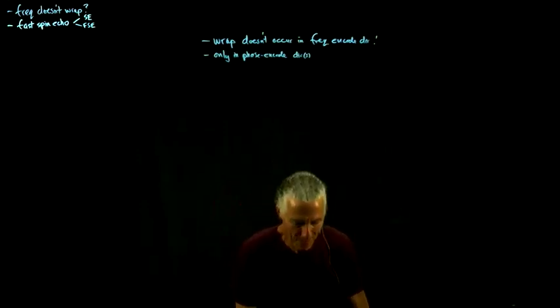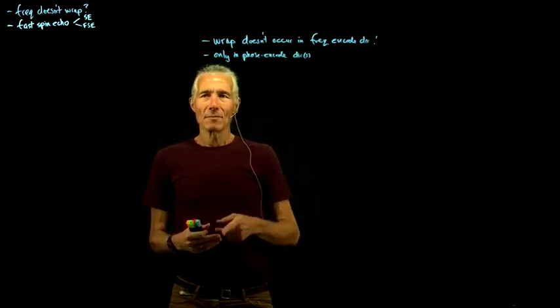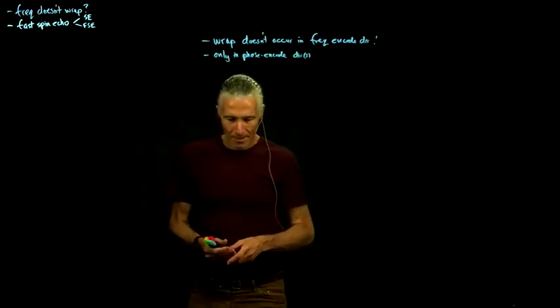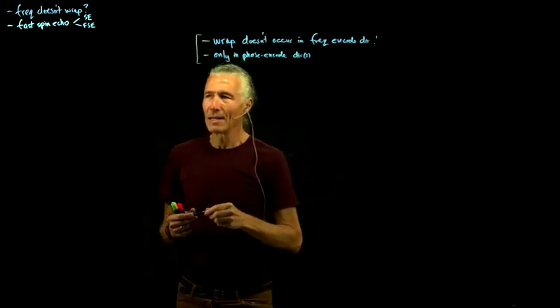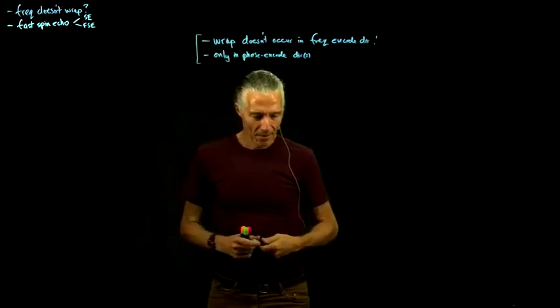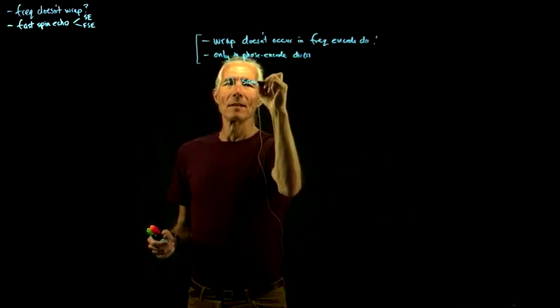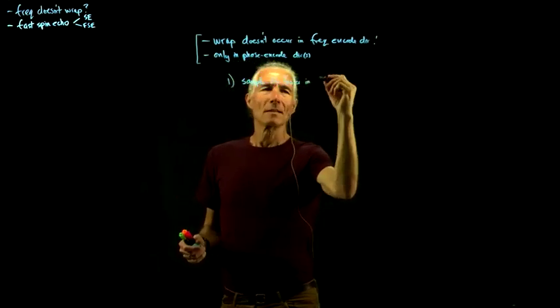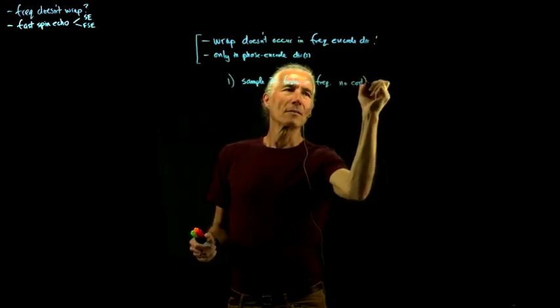Because as we see from the Fourier transform, the Fourier transform in the phase encode direction isn't any different than the Fourier transform in the frequency encode direction. So why is that? It's because there are two things that you can do in the frequency encode direction that you can't do in the phase encode direction. One thing you can do is just sample in the frequency encode direction two times faster. It's no cost to do that, because you're doing a readout.